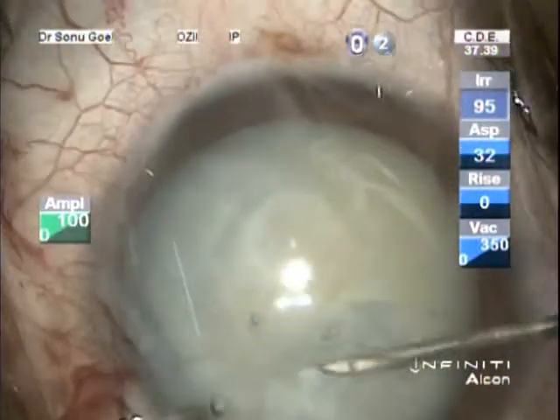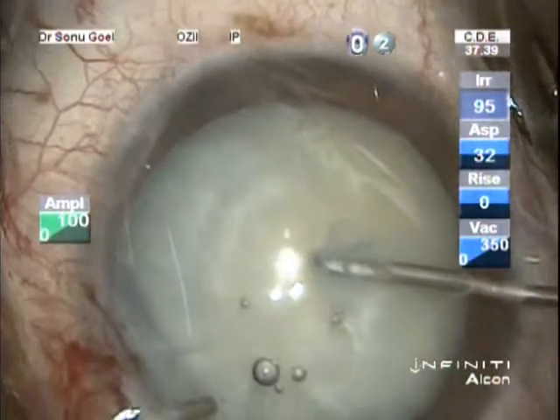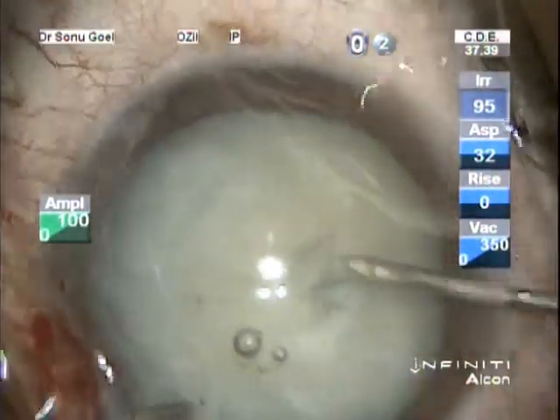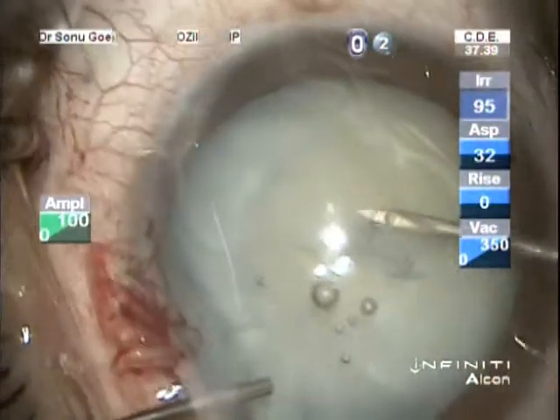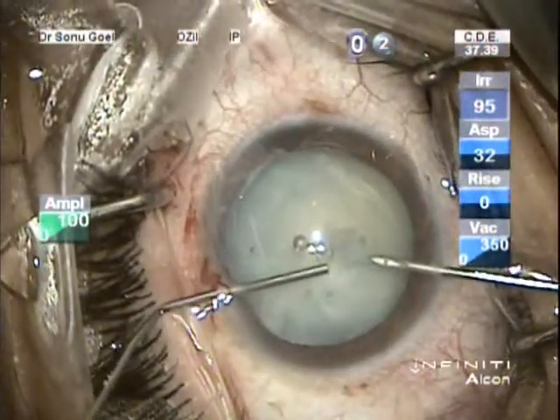We are maintaining a positive pressure, and see how beautifully a 5mm round regular Capsulorrhexis, despite this being a white cataract with high intralenticular pressure, can be made. Note here is made that if we slip off, again viscoelastic can be injected and the rhexis can be completed safely.